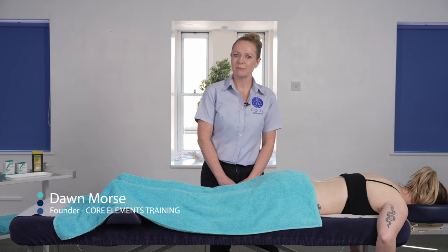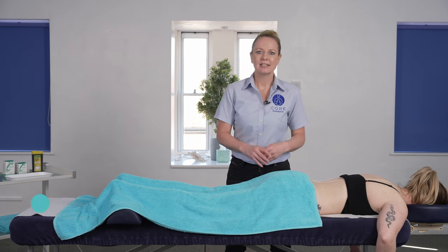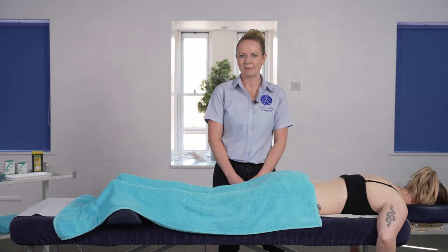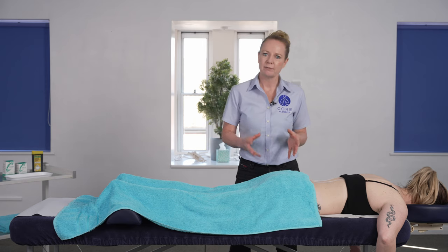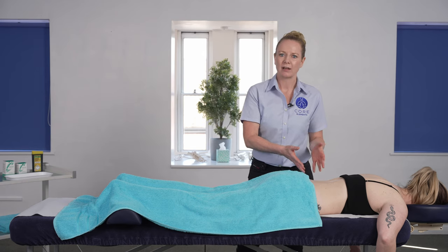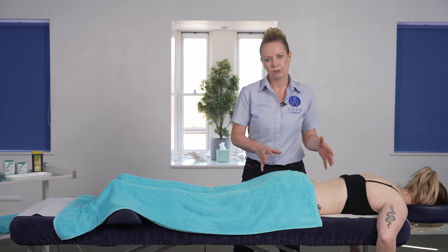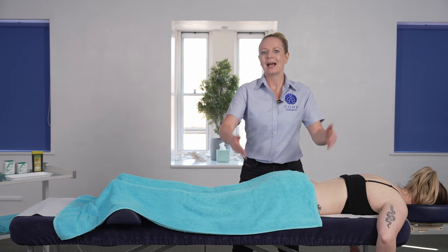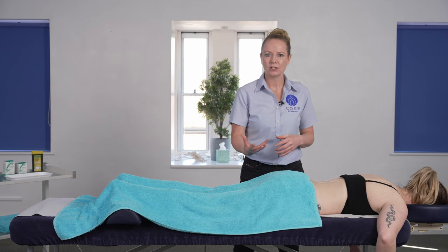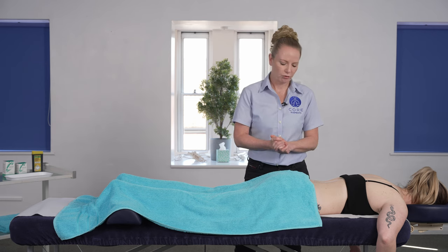In this video I'm going to demonstrate dry needling to the lumbar region. This is a great modality to use for clients that might be experiencing generalized lower back pain. As with any rounded treatment, we wouldn't just focus on dry needling to the lower back area — we would accompany this with wider treatment, probably to the gluteal region, to the hamstrings and to the opposing muscle groups as well. You can mix this with manual massage techniques or other modalities within that wider treatment.